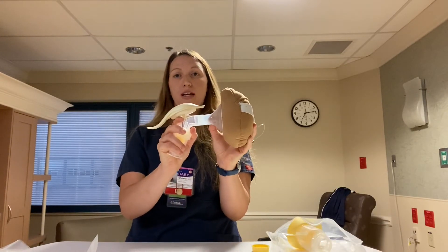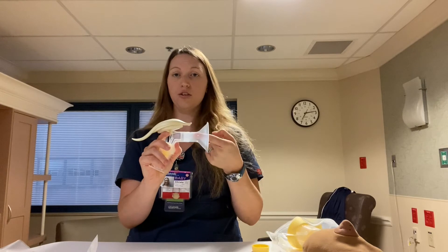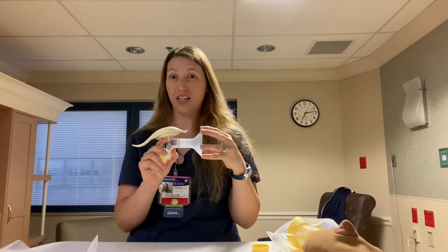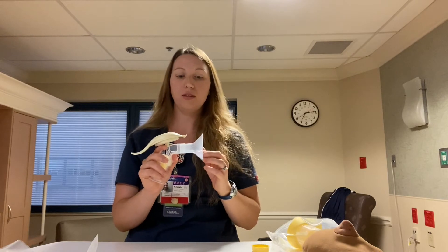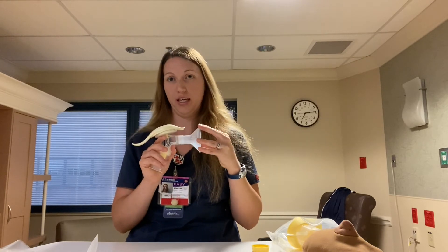We want to make sure the flange fits correctly for mom. The nipple should be going in and out freely of the flange. If the nipple is rubbing the barrel of the flange, we need a bigger size — that's going to cause a lot of pain and discomfort. Same thing if we have too much areola coming in and out of the flange, then mom needs a smaller size flange. We always want to make sure mom has the correct fit.